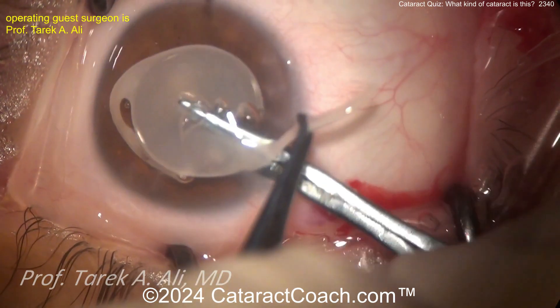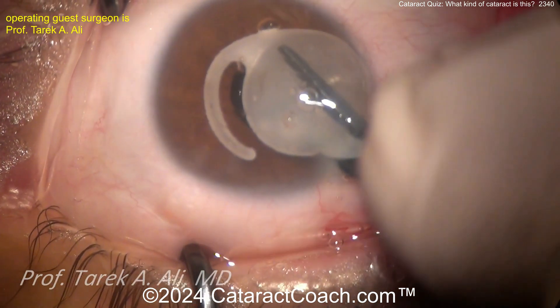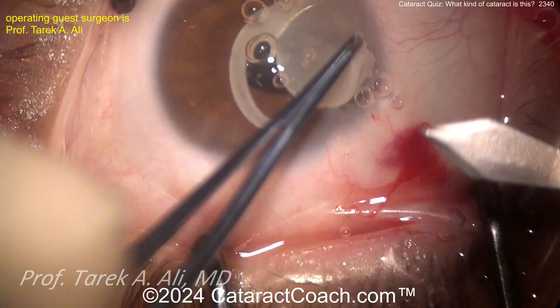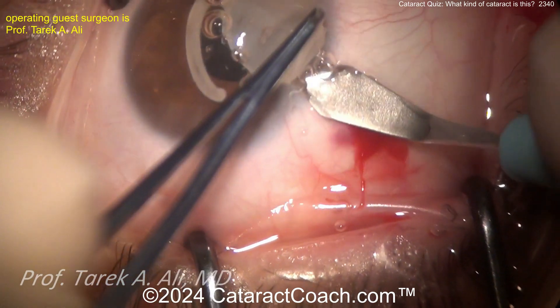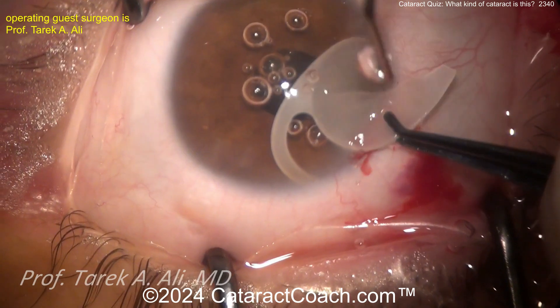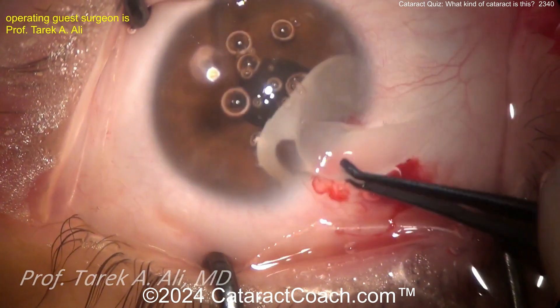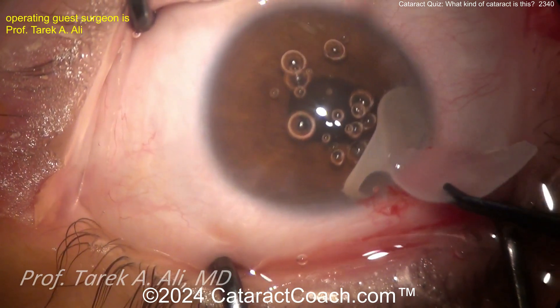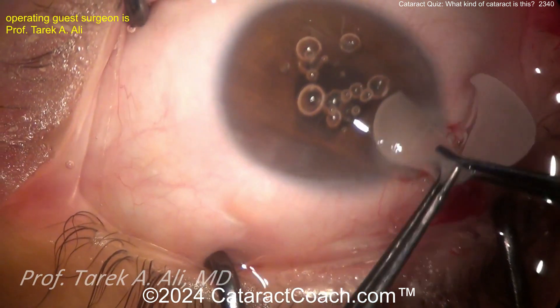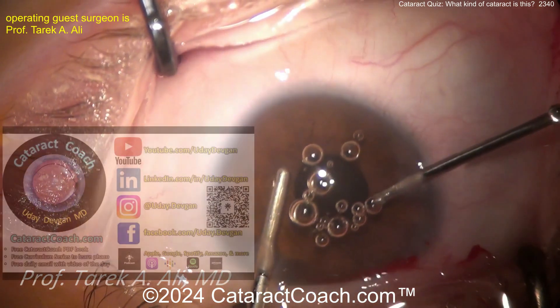Cutting all the way through — I like the technique of grabbing one haptic for some traction. The haptic even broke off, so this lens became a little bit more brittle. Cutting across and slightly enlarging the incision, you can get your cut mostly across, bring out half, and then kind of rotate it. You don't have to cut all the way through. Be careful — you may be damaging a little bit of endothelium at the site. Slowly rotate, rotate, pull it out, and there you go — the IOL is explanted.